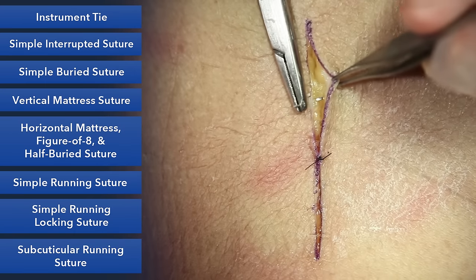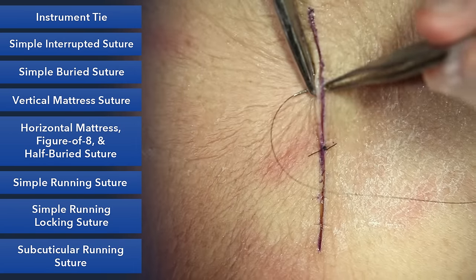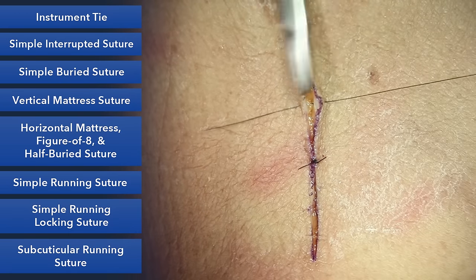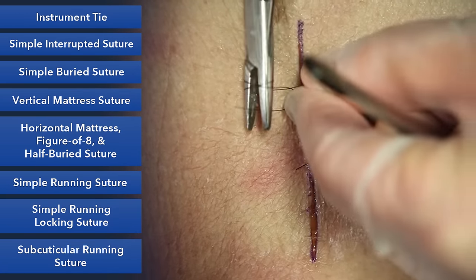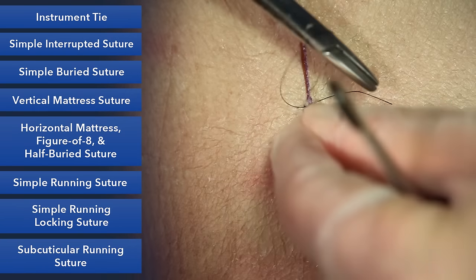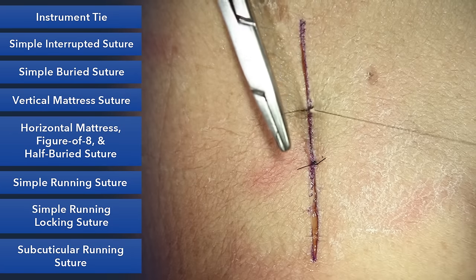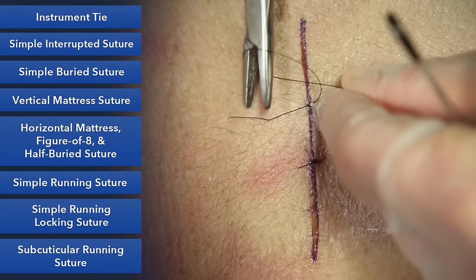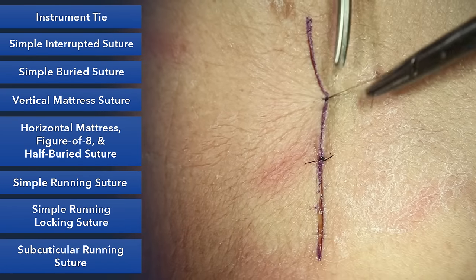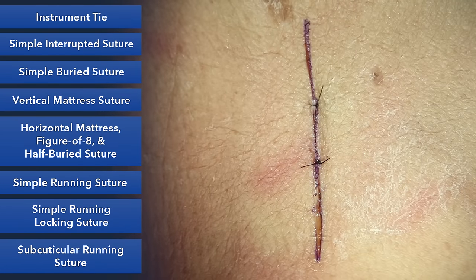So here again, exaggerate the 90 degrees on each side. Make sure that we are back the same distance on each side. An instrument tie, we do a surgeon's knot for the first. We cross the suture over, lay it down nice and flat. Don't pull up on it until we get the second suture down and tighten it and lock it in. So this is the simple suture. It's something that you'll need to practice a lot to master.